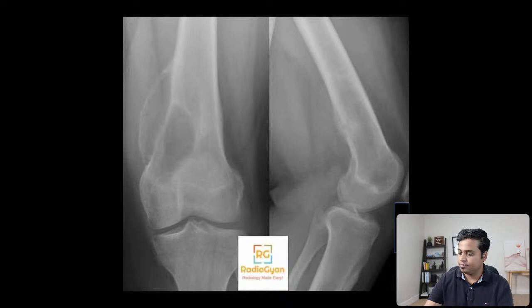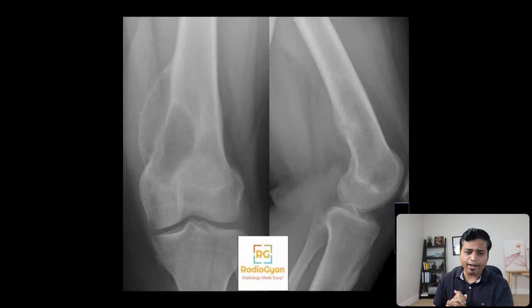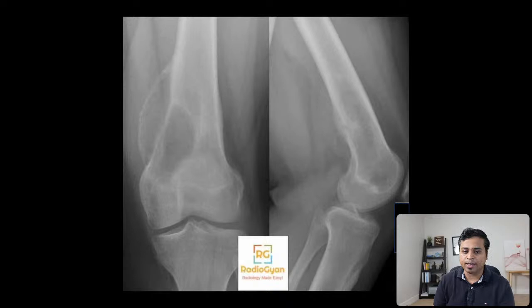Next case: we have radiographs of the knee. This patient also has MR which I can show. I don't see any ossification and this is an expansile lesion, so non-ossifying fibroma would go lower down. Osteosarcoma, given the location, is a good thought — but do you see chondroid matrix here?